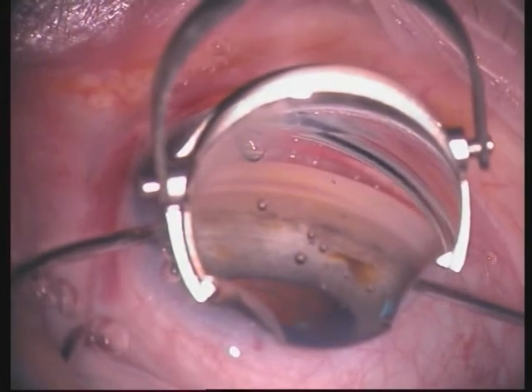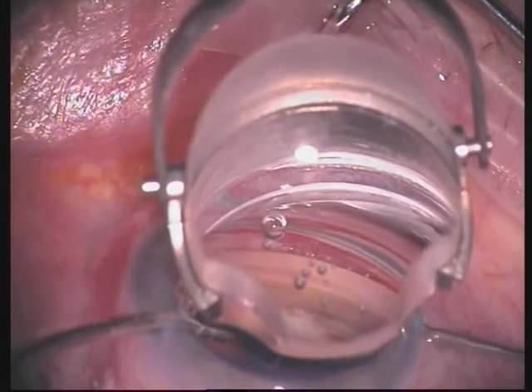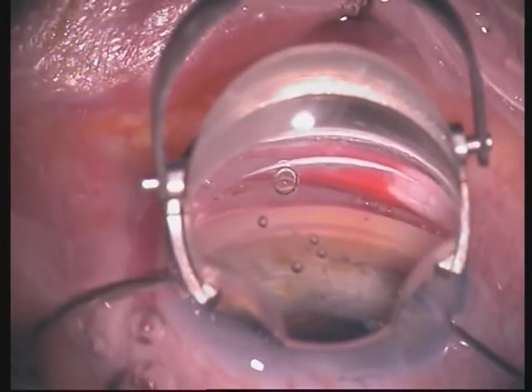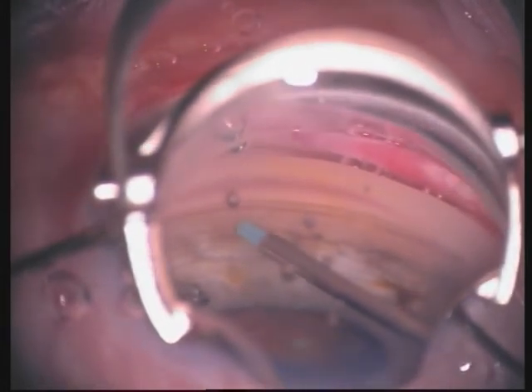In this case we would like to show a bimanual trabecular aspiration. The soft tip cannula is placed directly over the trabecular meshwork and under high vacuum it is moved gently over the trabeculum. Note the clear and stable view of the anterior chamber angle. The second hand is used for irrigation and stabilization of the eye during the procedure.